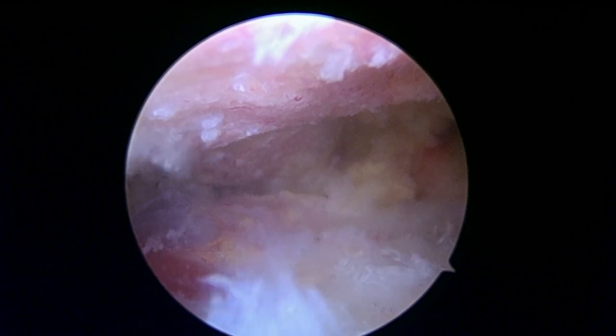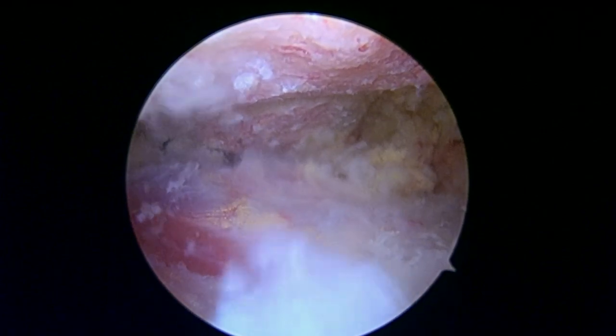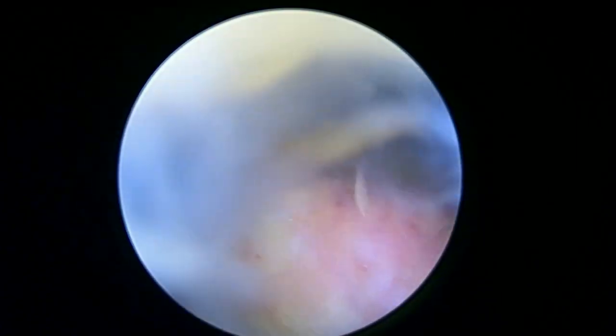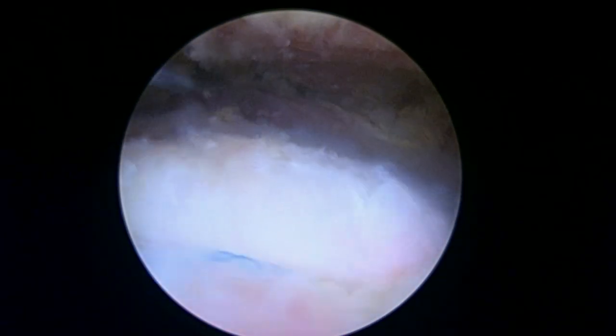Okay, we're all done here — let me show you where we're at. As we look back here, you can see the knots that are tied. There they are — that's the one rip stop stitch, and the second one is just parallel to it, just a little bit more medial. I like the way that looks. That's what we're going to finish up with — we're going to get you back to the recovery room shortly.